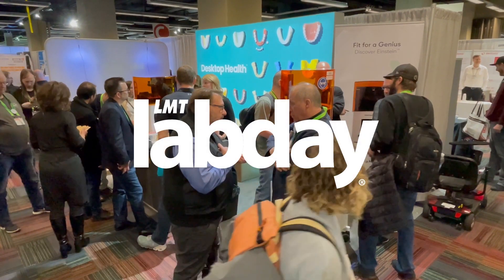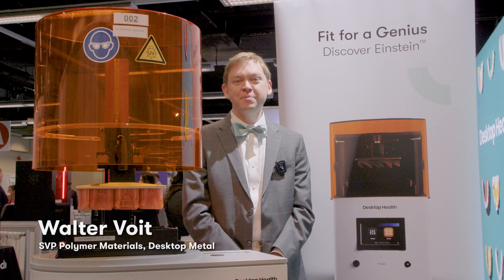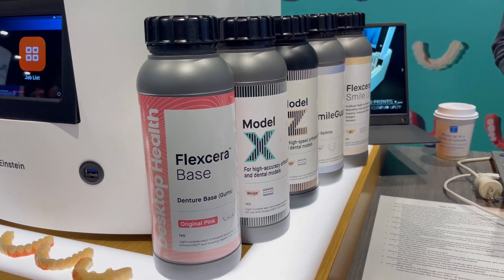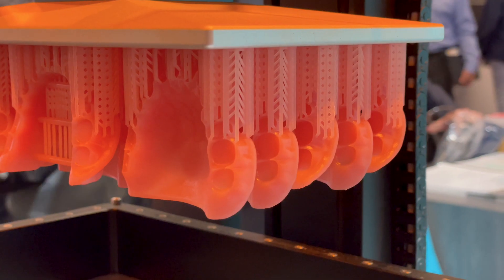We're here at Chicago Lab Day and we've recently launched the Einstein Pro XL, one of the largest high-production DLP printers for printing premier dental products like our Flexera brand resins, including Flexera Smile Ultra Plus and Flexera Base.